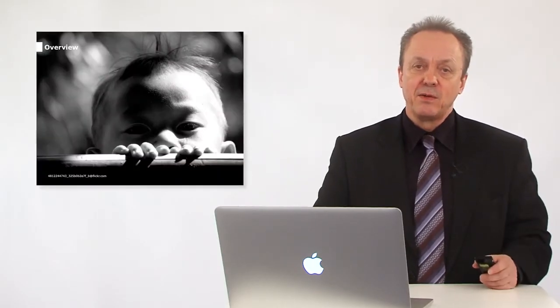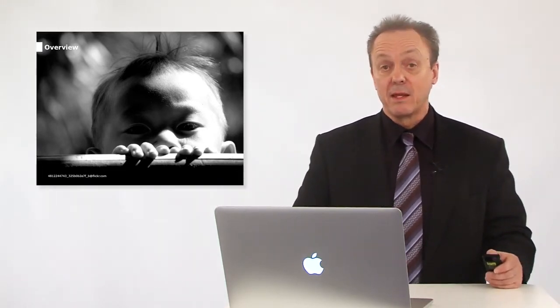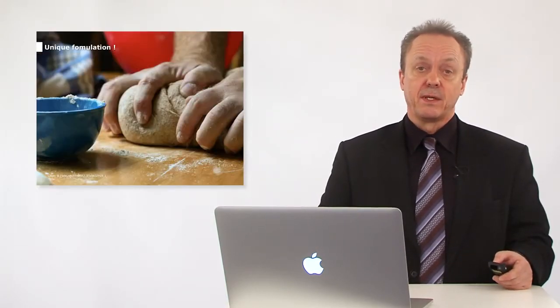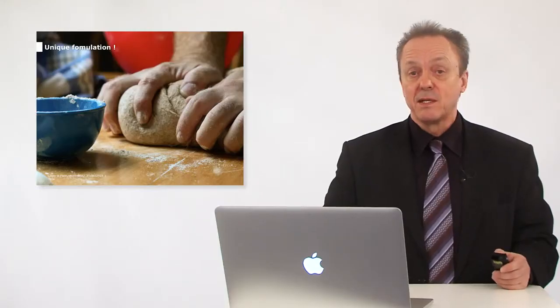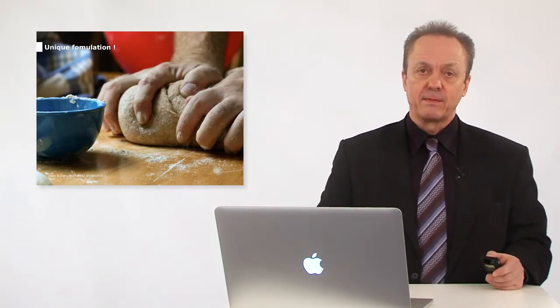I would like to give you an overview as to what kind of material properties make the new Honigum Pro ideal for the dentist. With all our experience, we have developed a new and unique formulation. This means we have a rheologically active matrix, a kind of crystal matrix, enhanced with the latest fillers.